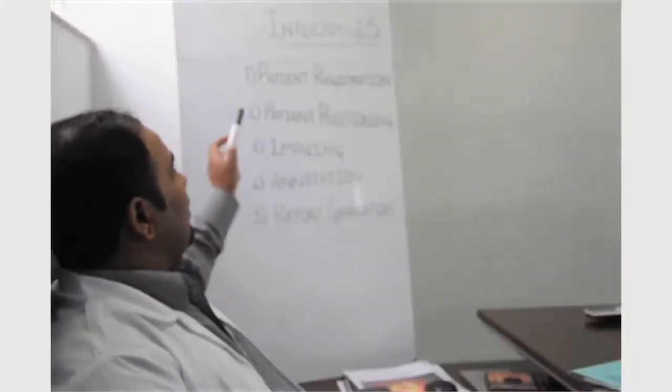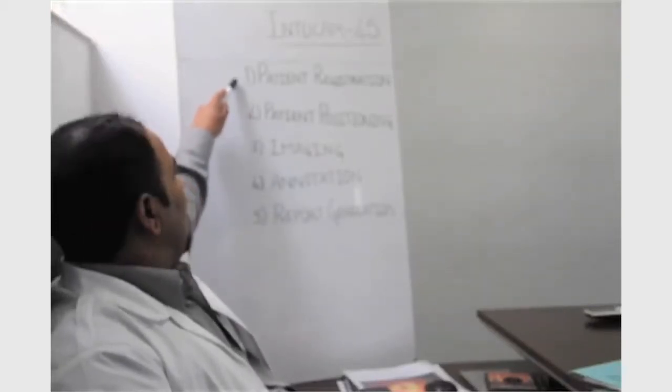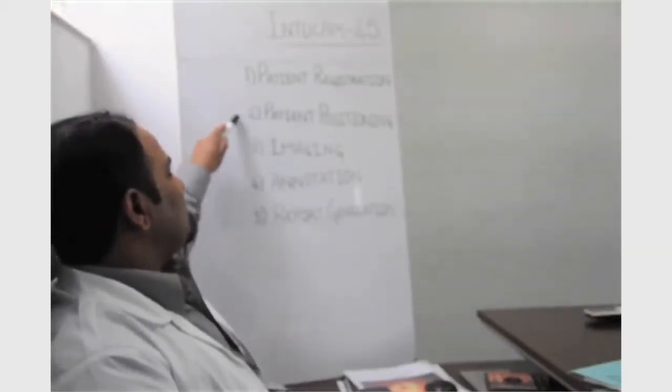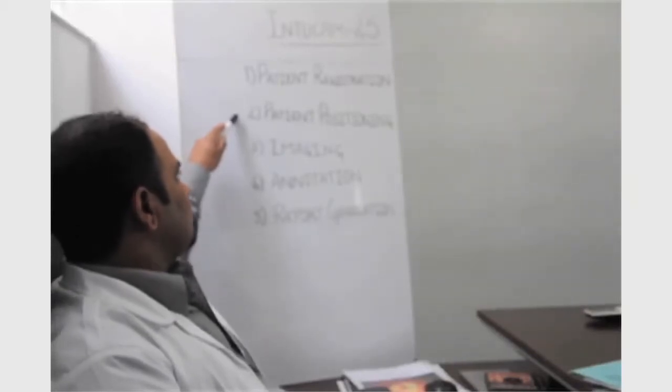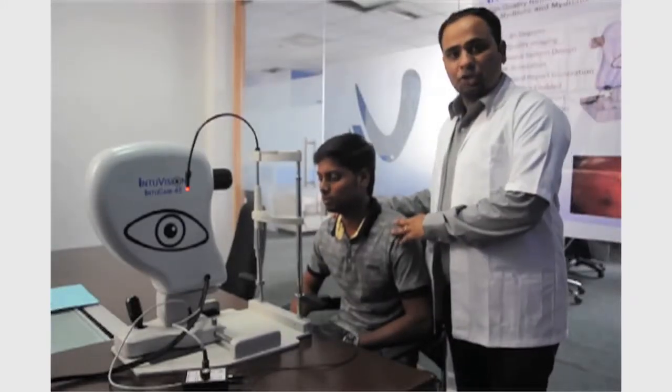Going back to our flowchart, we are now done with the patient registration. Now we will move ahead to patient positioning. While doing the patient positioning, it is very important to explain the entire procedure to the patient so that he or she feels comfortable throughout.